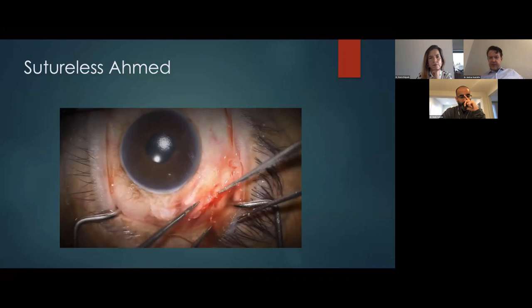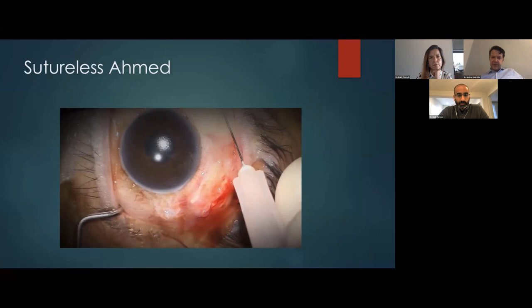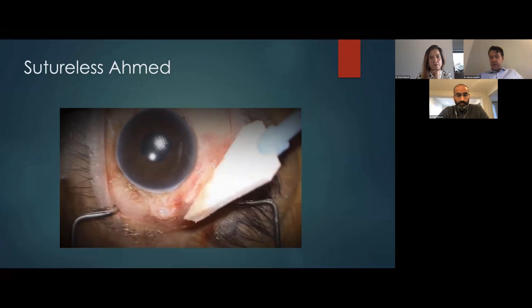And now I'm going to give a steroid antibiotic, and it's amazing. Just 30 seconds or so after we closed, the fluid from this steroid, I don't show it in this video, but sometimes I'll have it come over and elevate my recently glued area of conge, and it usually stays together through that challenge.